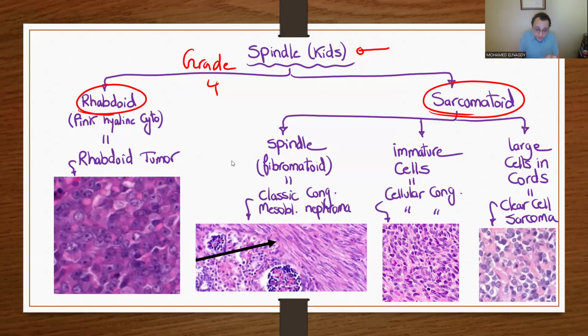Yeah, that's exactly what you said. A high grade nucleus pushed to the periphery. High grade, I mean it has prominent nucleoli and it's staring at you under the microscope. And what pushes the nucleus to the side is how the cytoplasm looks. The cytoplasm is, as you mentioned, pink, but they call it glassy pink. You remember this word, I think. You heard it somewhere. It's glassy pink cytoplasm, which means it's pink and refractile. It looks as if you're looking at a pink piece of glass. That's the glassy pink cytoplasm. When we see these features, we say this is rhabdoid cellular features.